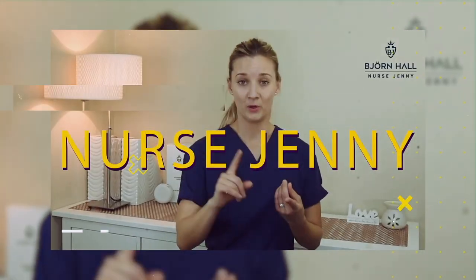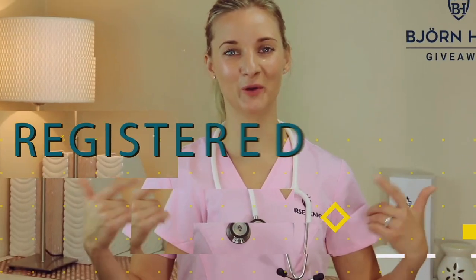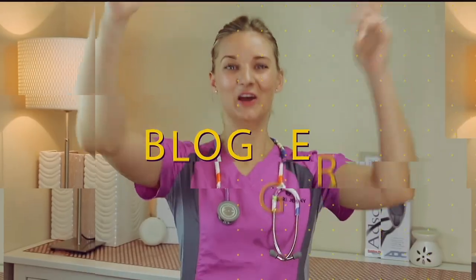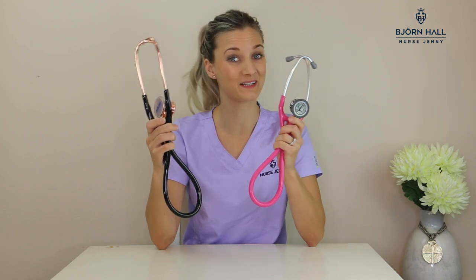MDF Classic Cardiology versus the Littmann Cardiology IV. These are two very popular cardiology stethoscopes. I'm going to break down their features so that you know what makes them different.